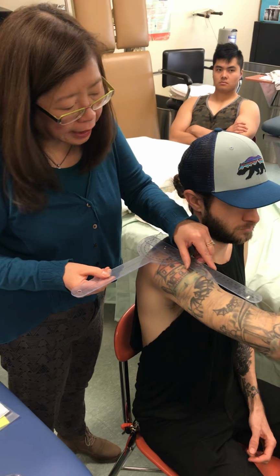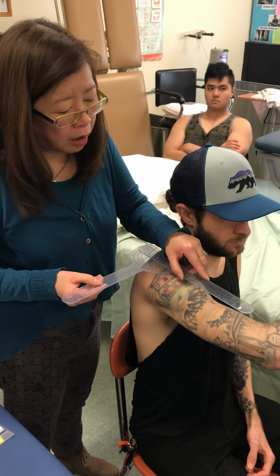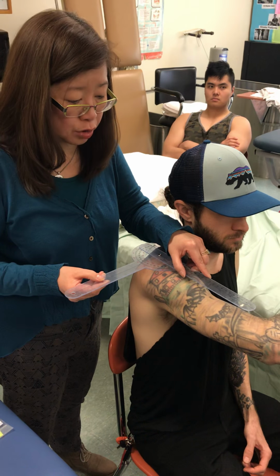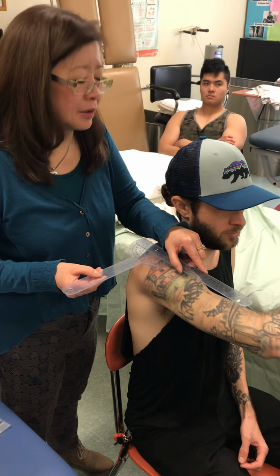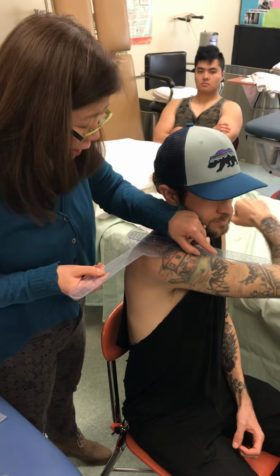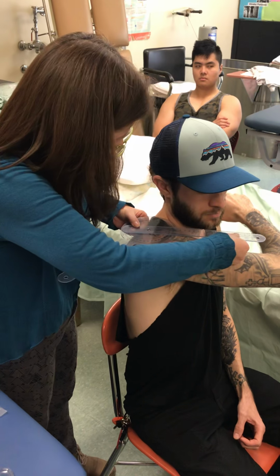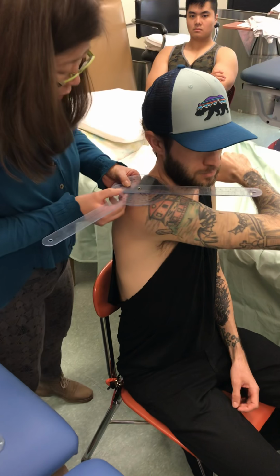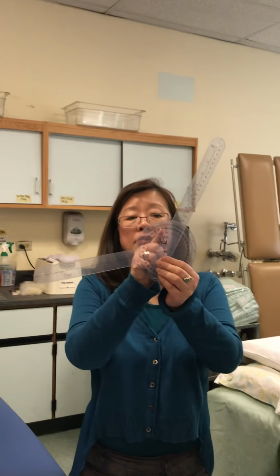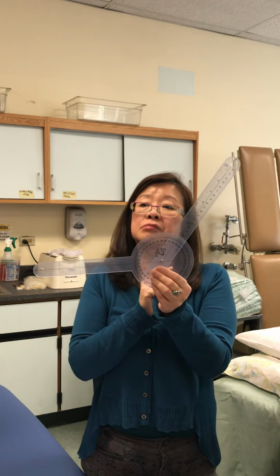we're going to do horizontal adduction. What am I going to ask him to do? Cross your arm across your chest, please, for me. Keep going as far as you can. Line it up as far as you go. Okay, bring it away. Put your arm down for a second. So he went from 90, which is 0, 10, 20, 30, 35 degrees.